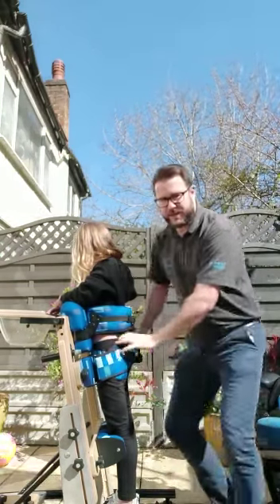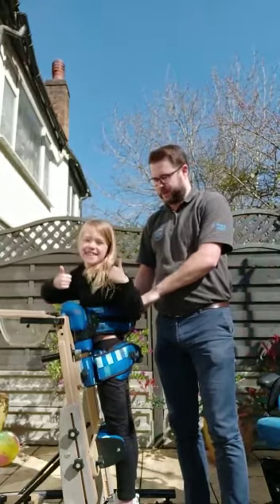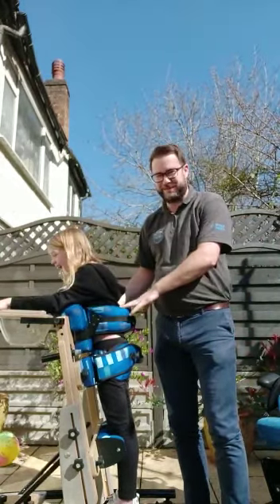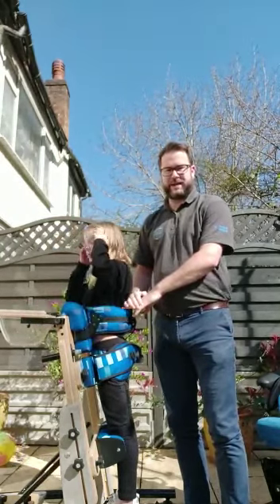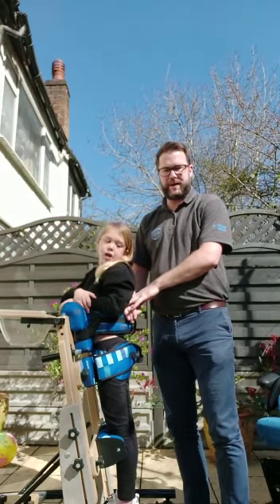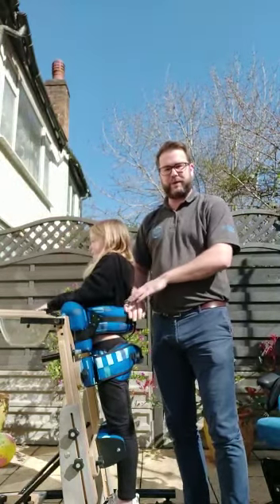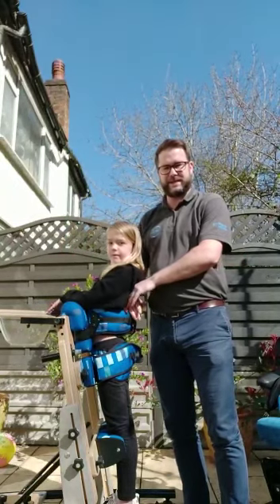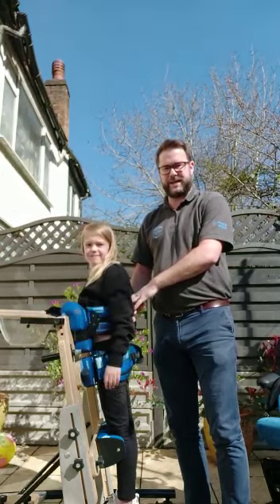So that's how you do a standing transfer from the seat to the standing frame. To reverse it, just do all of that in reverse. You really need to use the high-low function to get their feet already in the standing frame, then a little bit of tilt if needed to help nose go over knees, then come to the side and help your child facilitate into it.